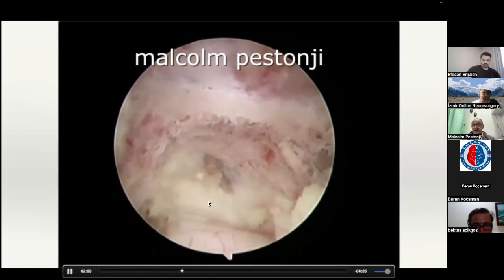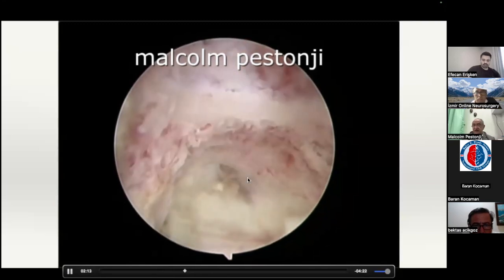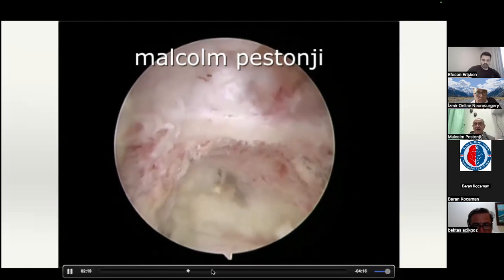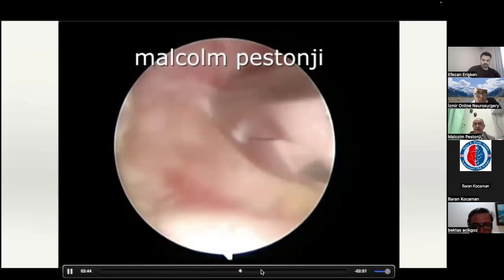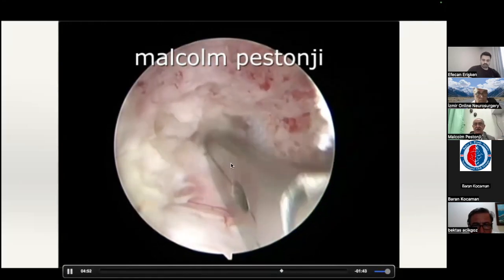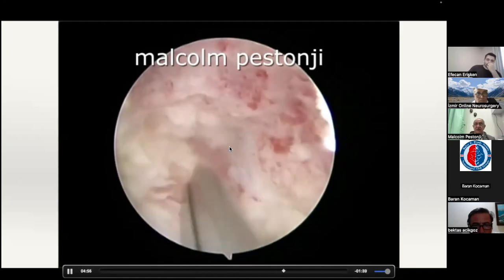Below here is a discal surface. Cut SAP, IAP is intact. Rest of the SAP is intact. Rest of the opposite joint is intact. Dura is below. We've done a pretty decent job. We're cleaning up over here. Slowly checking out on the discal surface. You can see the discal surface below us. And you can see the full root over there. Can you see that root? I'm stretching out the root to show it to you.